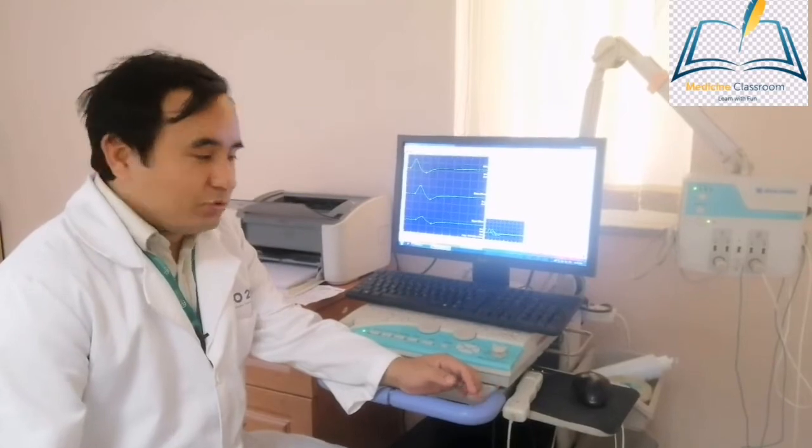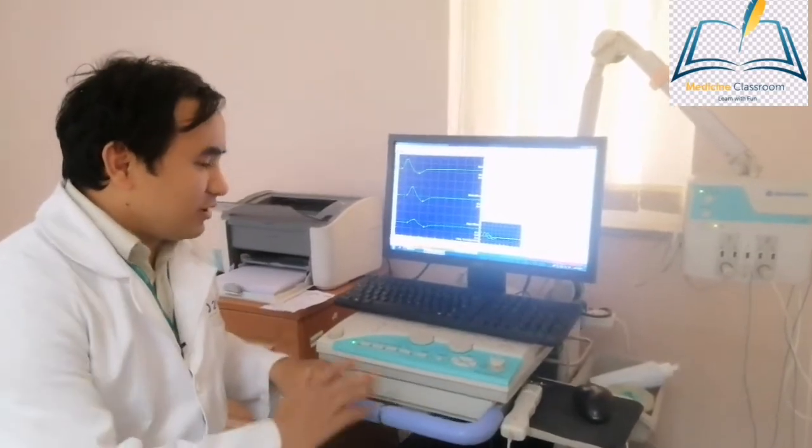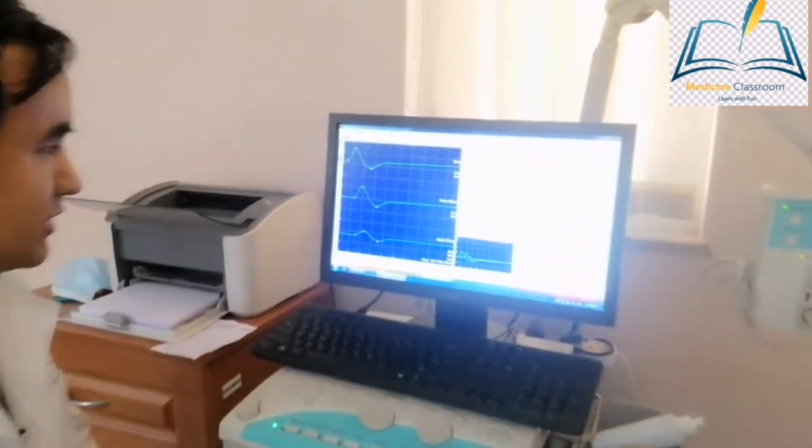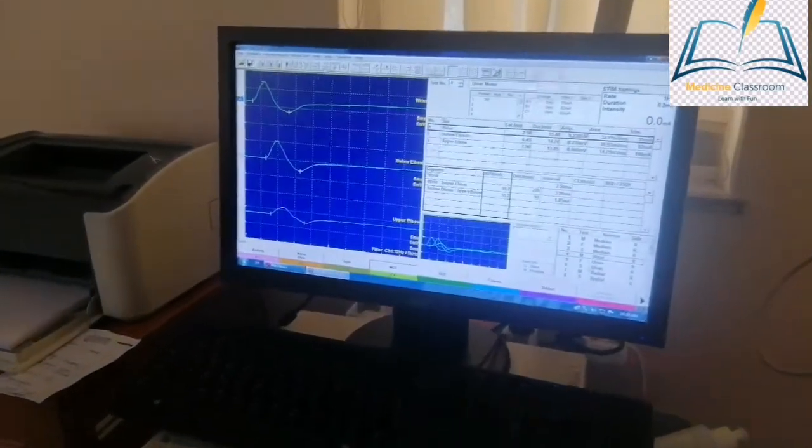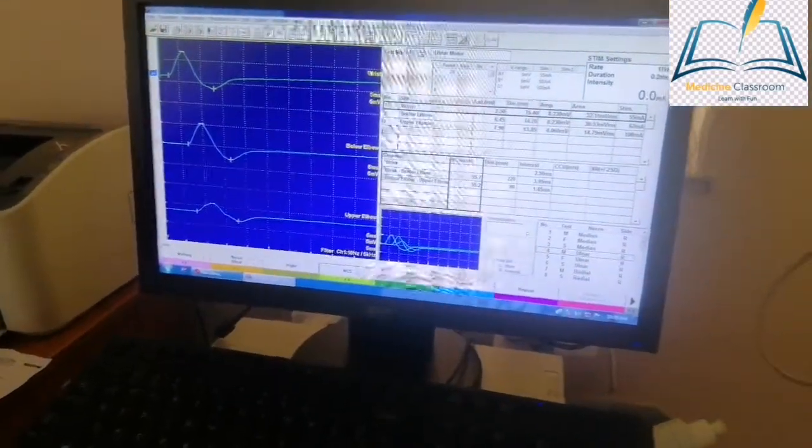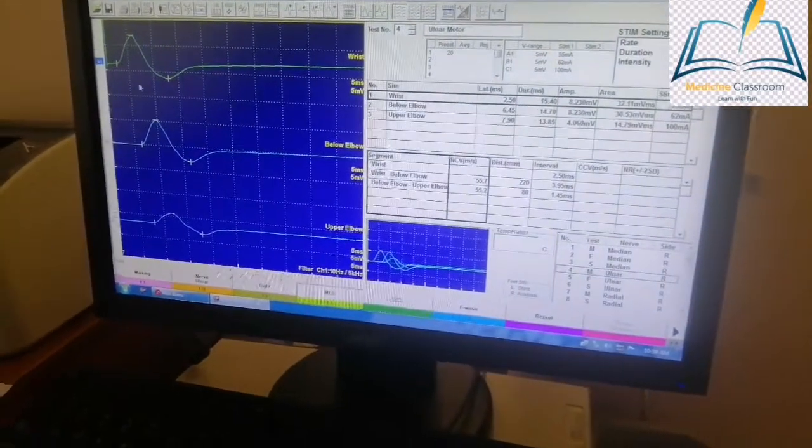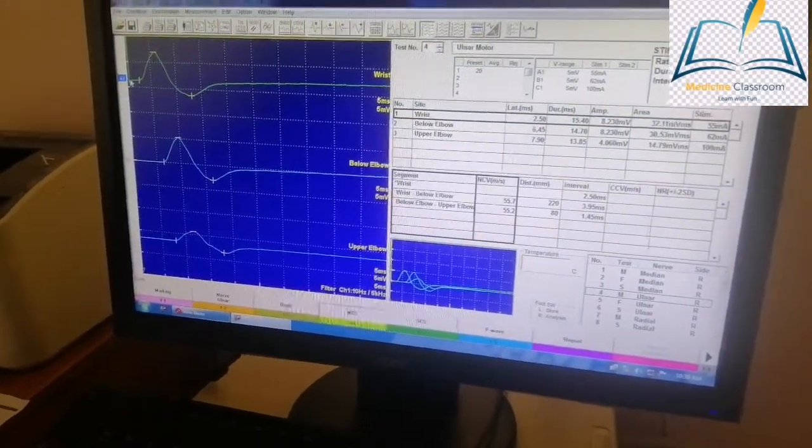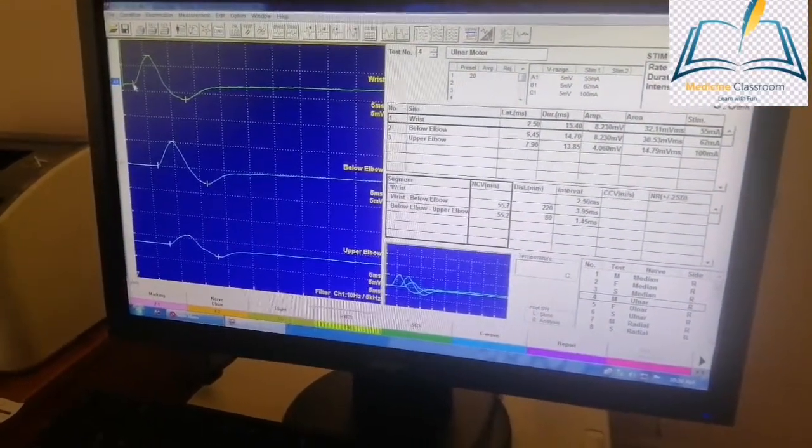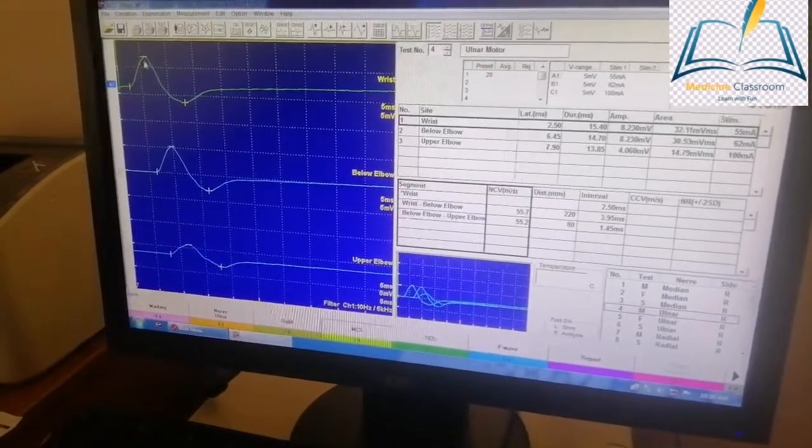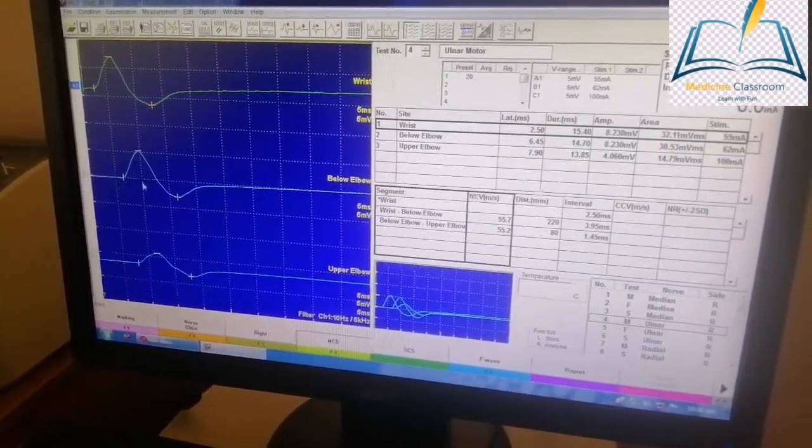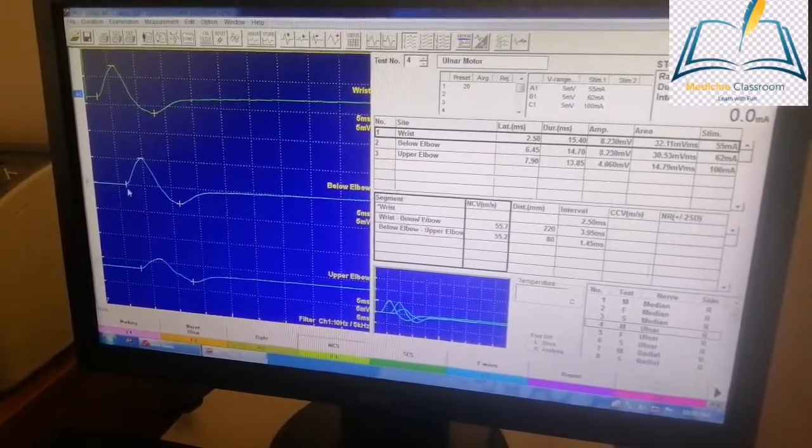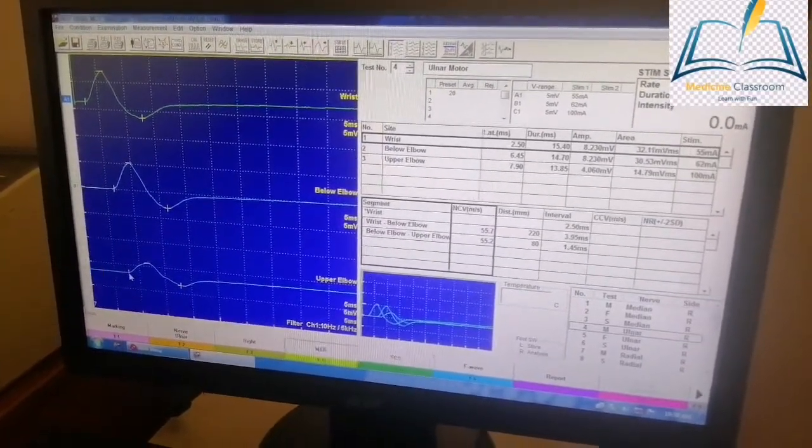We have done nerve conduction studies of many nerves, but let us look at the motor conduction study of the ulnar nerve. What you can see here is the stimulus and this is the onset of the motor unit action potential. This is the below elbow stimulus for the ulnar nerve and this is the upper elbow stimulus for the ulnar nerve.